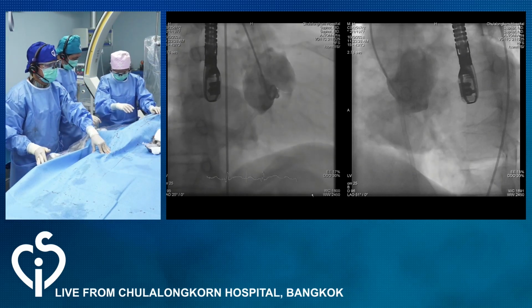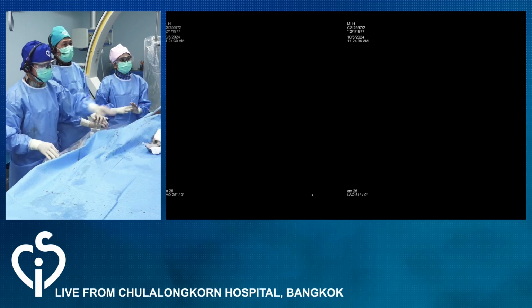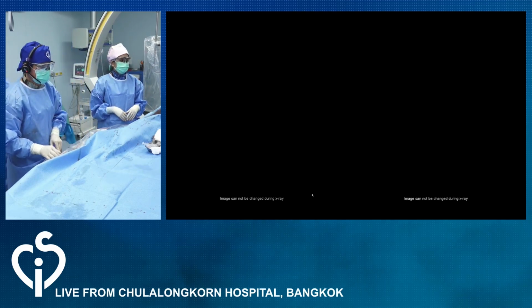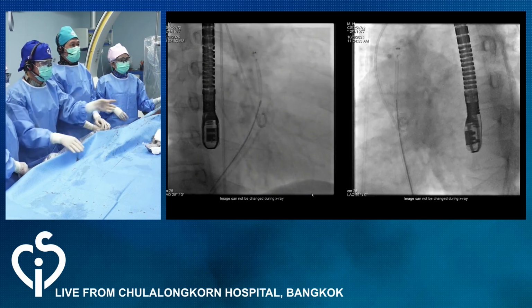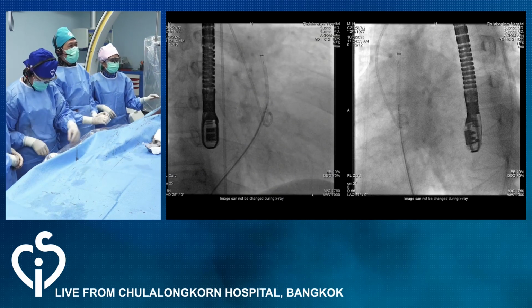Yeah, looks small. I think in this case maybe 8/6 or 6/4, because if the disc is too large, maybe the coronary artery ostium is just around. Yeah. Okay, good point. So let's see.